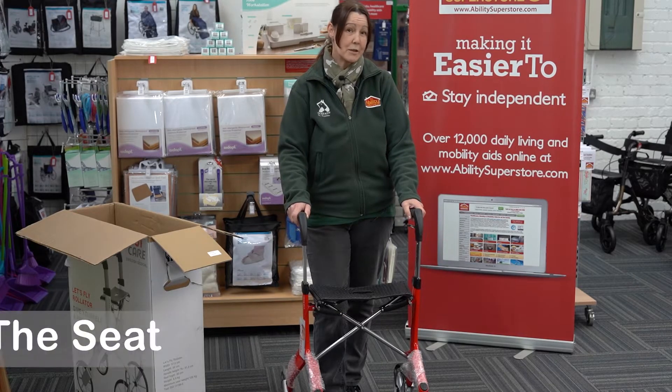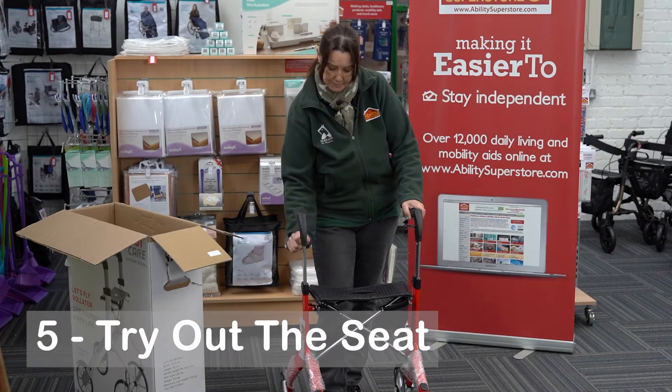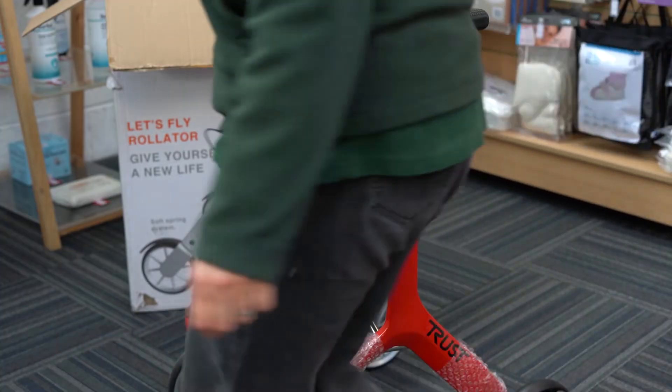If you need a seat while you're riding about, you can simply lock it into place like this and use this as a seat - very comfortable.